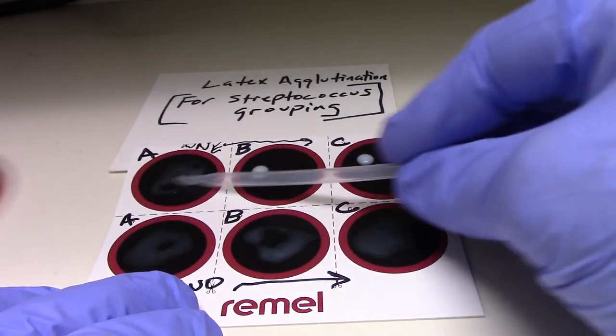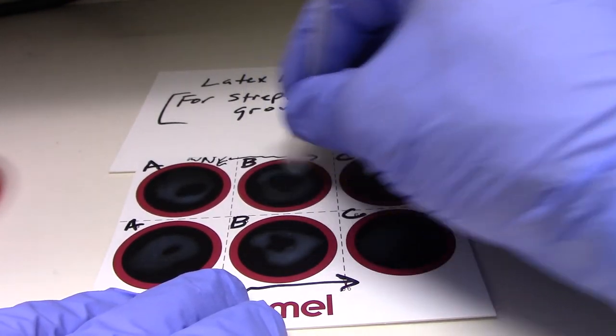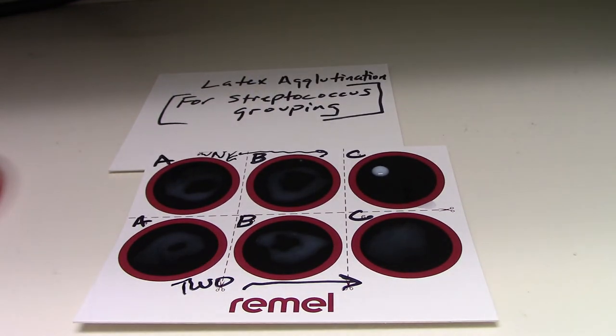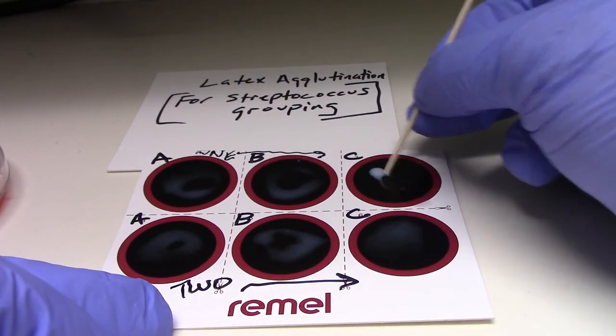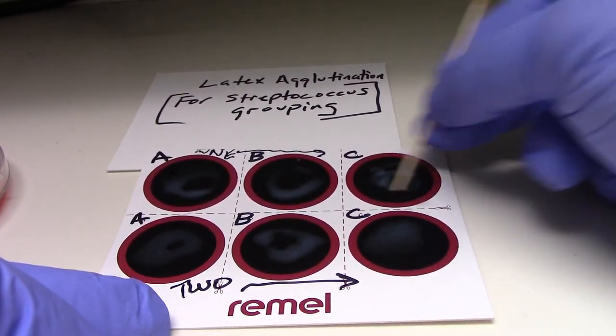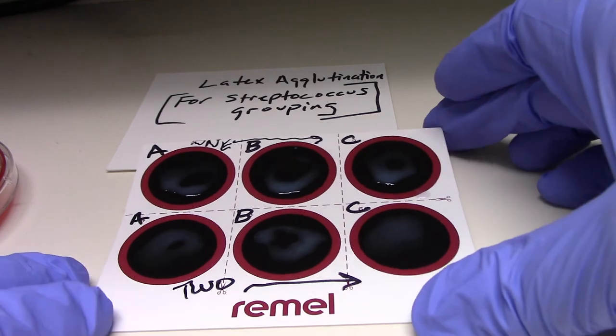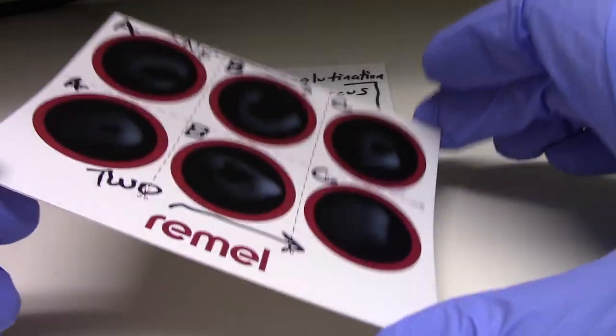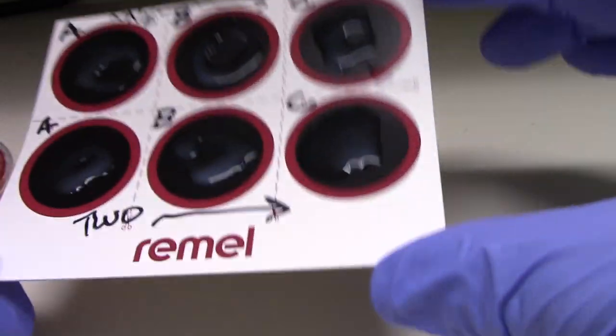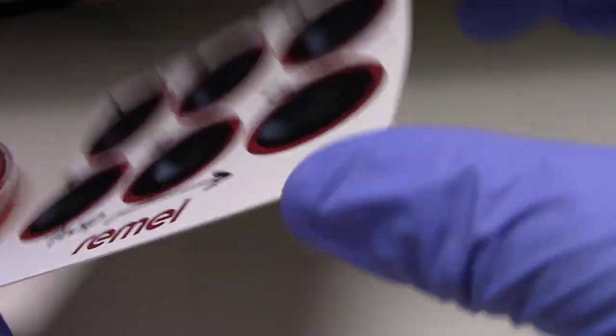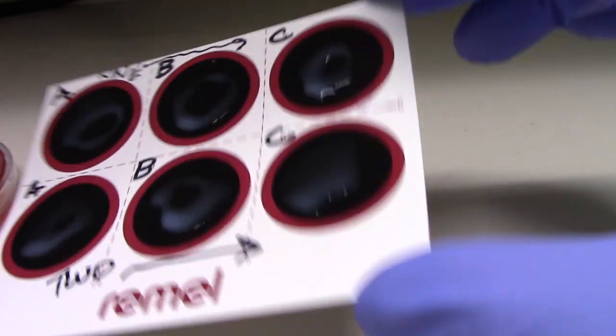A, reaction with A. Reaction with B. Reaction with C. And now we're going to look for agglutination to detect whether or not we have a type A streptococcus, a type B streptococcus, or a type C. I will mix this for a moment and then we will make our decision.